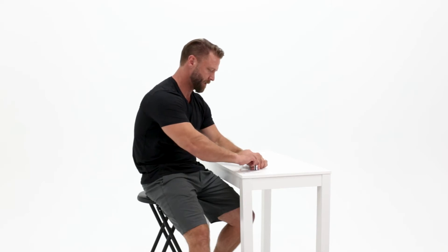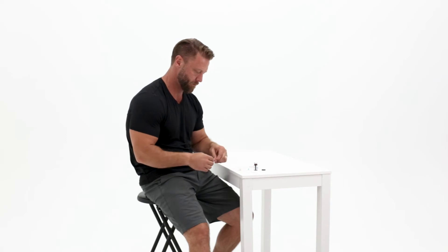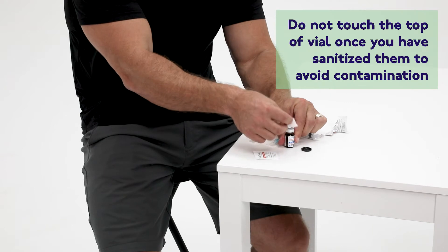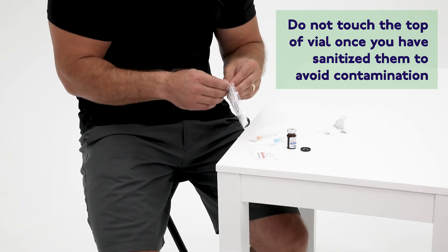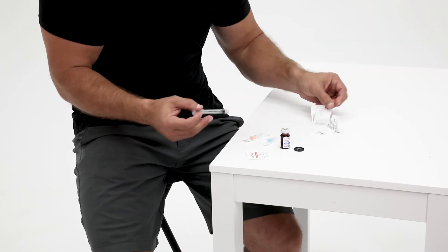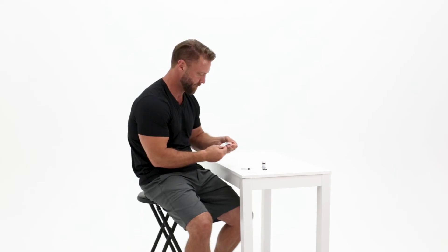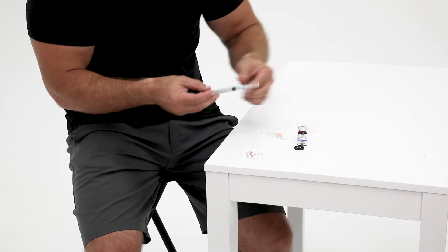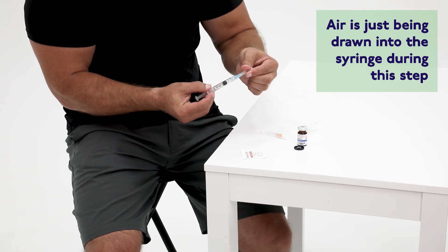Start by flipping the cap off of the vial of your prescribed testosterone medication. Wipe the top of the vial with a new alcohol wipe. Now take your syringe and 23 gauge needle out of its wrapping and attach the 23 gauge needle to a small syringe with plunger. Pull back the plunger to the black line which your healthcare provider has prescribed.